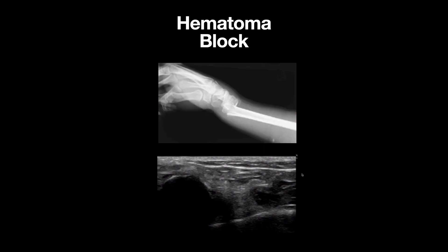In this image we can appreciate two distinct bony structures demonstrated by hyperechoic surfaces with posterior shadowing. On the left side of the screen we can see the distal fragment that is displaced dorsally compared to our proximal fragment seen here. This anechoic area represents the hematoma where anesthetic should be instilled to facilitate reduction.